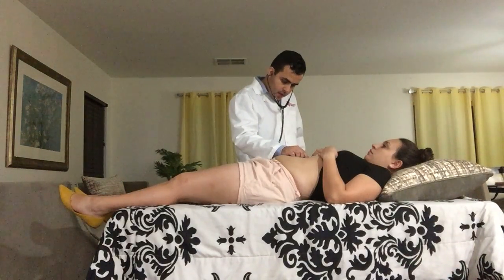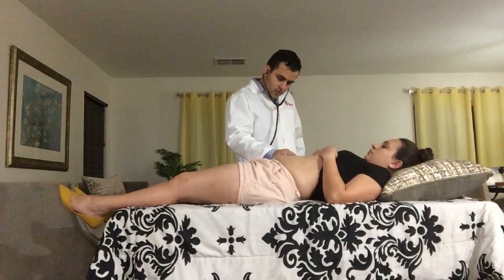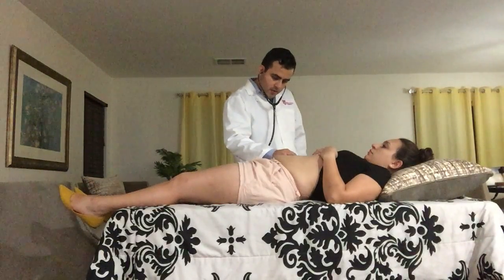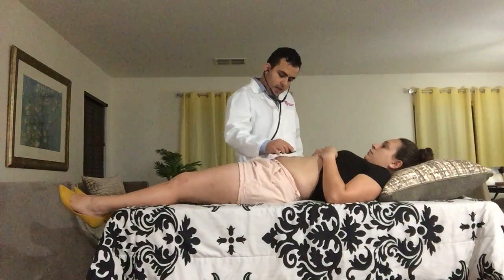So now I'm auscultating the aorta, renal, and I'm going to check bilateral. Same thing with iliac.